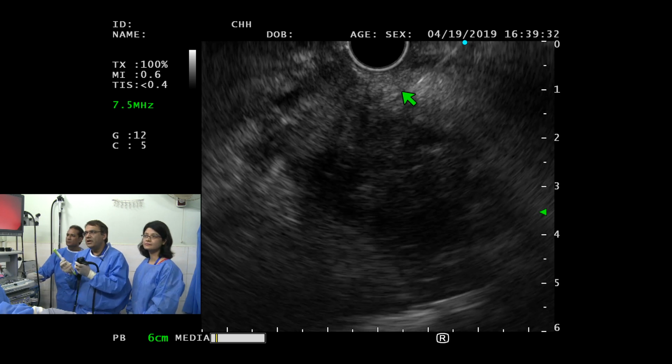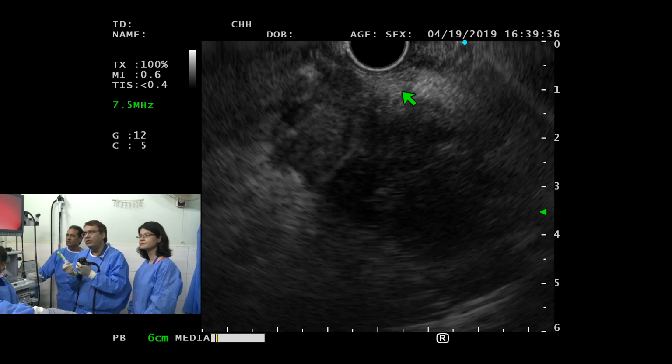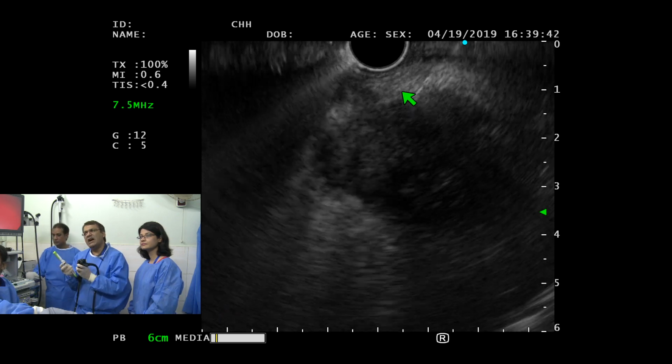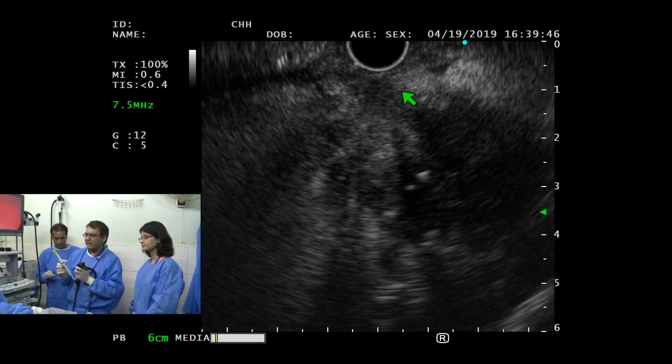So here it's a lot of necrosis. So I may change my rule and may go 5 or 6 times in there. So I need some viable cells, and I may not be able to get any viable cells, to be honest with you. But this should have cells in there.